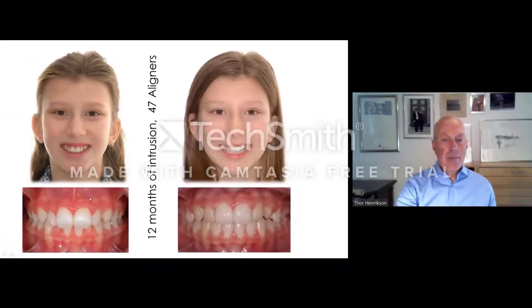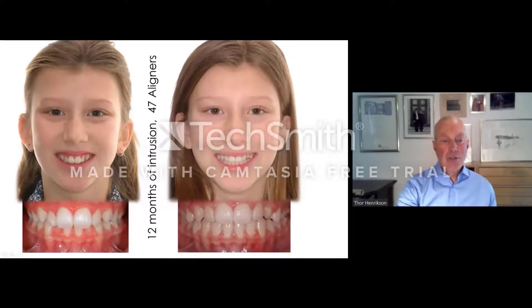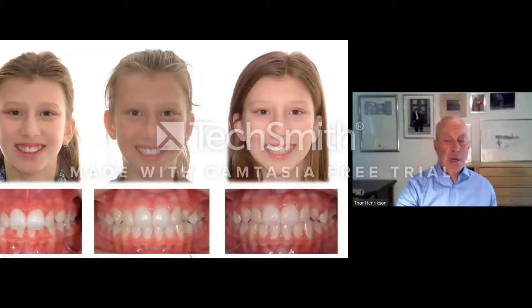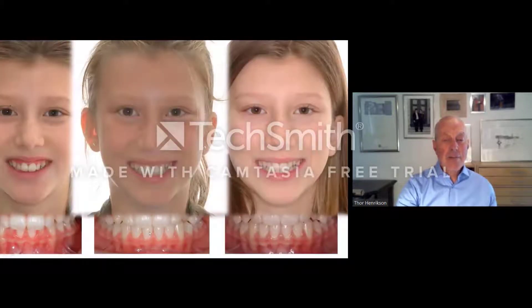This is the amount of intrusion we got after 12 months of treatment, and at least it looks like we got the desired treatment goal. So this is start, 6 months, and after 1 year. Doing selective intrusion with fixed appliance is of course possible, but you have to work with auxiliaries and probably put some tabs. This is quite easy to do with aligners, so this is something we are looking forward to working much more with in the future.